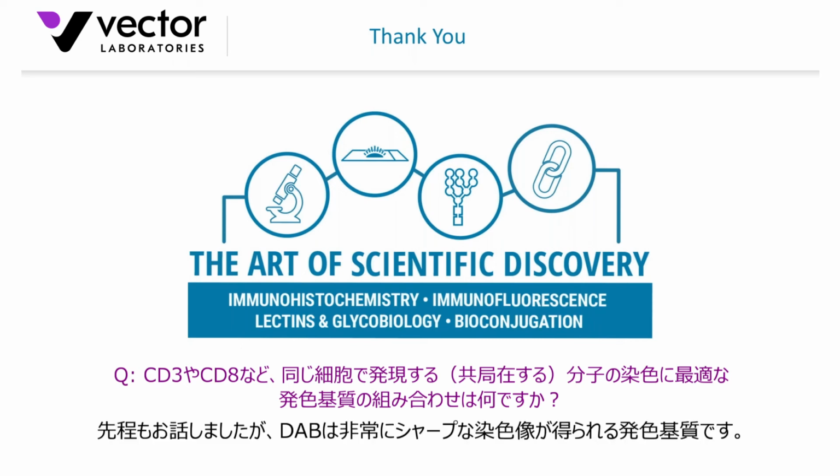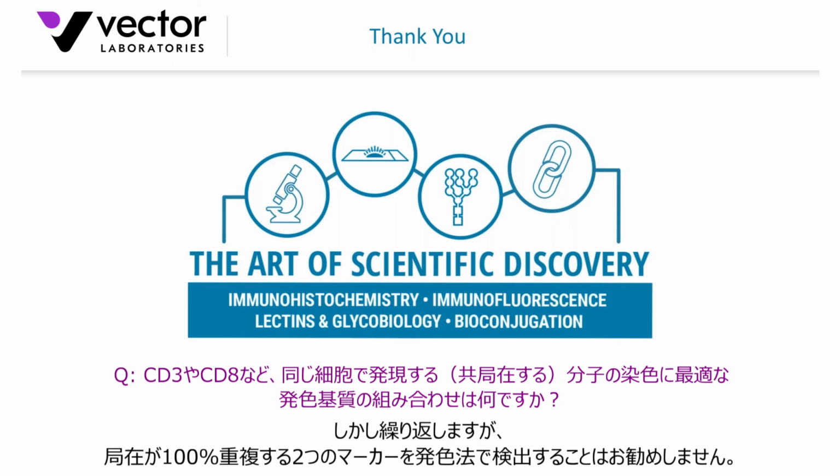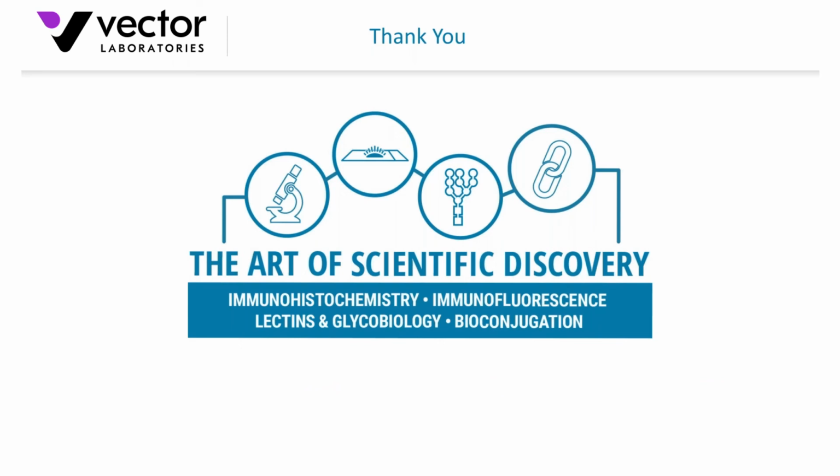Again, as I pointed out, DAB is widely used. It gives a very nice, crisp demarcation. You could use that for the membrane marker in that instance, and then use an alkaline phosphatase for the nucleus, or indeed the cytosolic marker. But again, I'd hesitate to recommend co-localization of two membrane-based markers where you do expect 100% overlap.